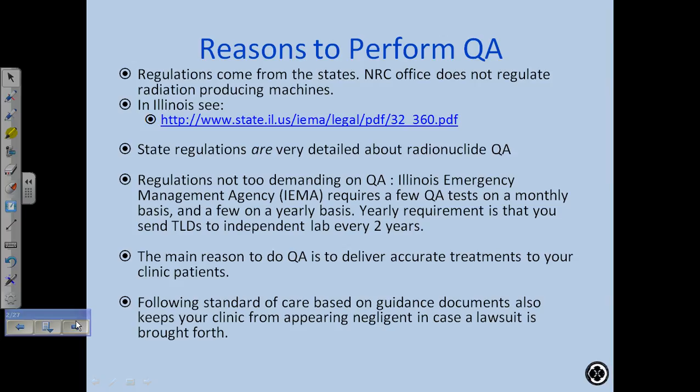Okay? And therefore, our role over the last few years has changed significantly because we're more involved in the QA program itself and less involved in just, okay, I'm going to QA the HDR unit, I'm going to QA the Linac. We need to bring it all together as an entire program. And so like I said, we're more involved these days, but we don't have the training to do it. Okay? There are several courses that you can take, training in radiation safety and QA. One of my colleagues is going to a minimizing patient error meeting. So he's going to go there, learn about it, and bring it to us. So this is our challenge right now. We're really busy in the clinic, and things keep coming up. Like new technology comes up, and now this QA involvement, how we have to be involved in the QA process. So our role is changing over time, and it's making our role more of a challenge because we have to learn a lot more these days than we did before.